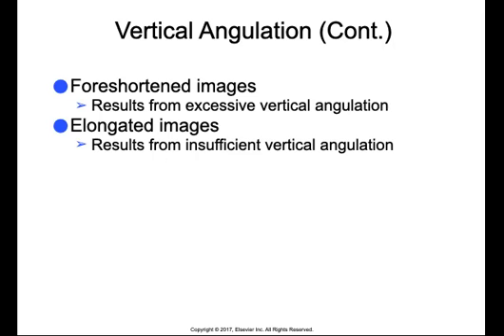So these are good starting points to get yourself acclimated with all the angles. But once you have gone through the ranges of all these recommended angles and it's still not giving you the correct image that you're looking for, just know that sometimes we may need to go outside of this box and really look at the angles in our patient's mouth and figure out where that bisecting angle is, and then adjust your PID accordingly.